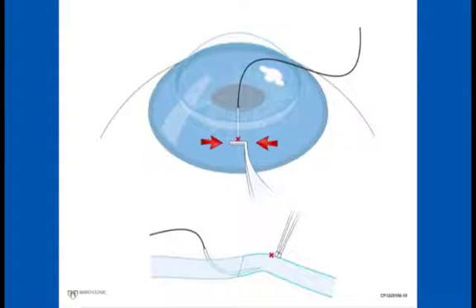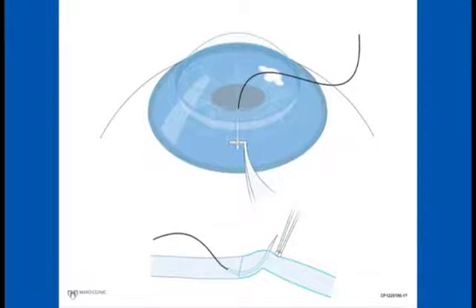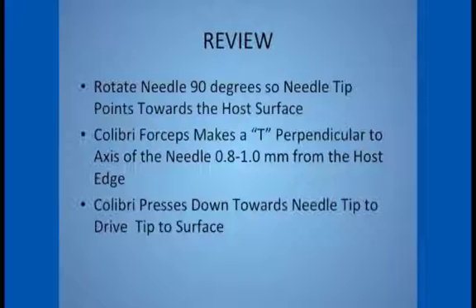The colibri is positioned on the host surface in a T position where the colibri is perpendicular to the axis of the needle and the needle tip is halfway between the two edges of the end of the colibri. Note that the colibri is also positioned about a millimeter from the host edge. Press down and actually cornea the needle instead of needling the cornea. If you have all your positions correct, it can only exit exactly where you plan to exit and should have the correct depth, length, and radiality.